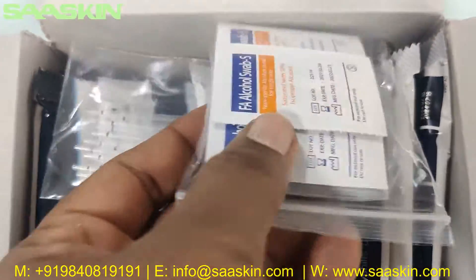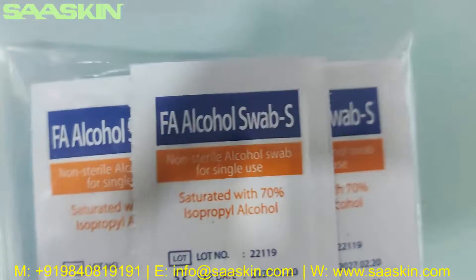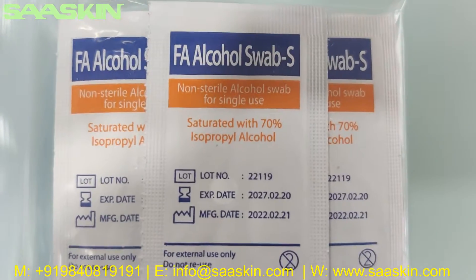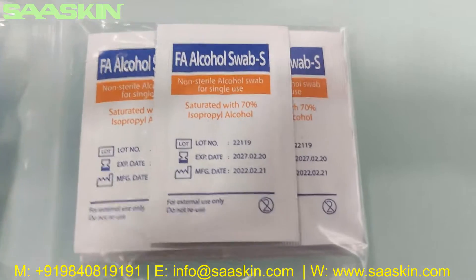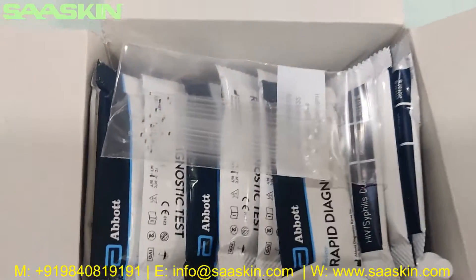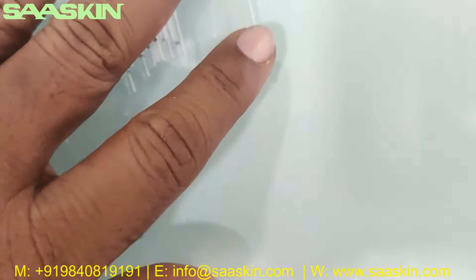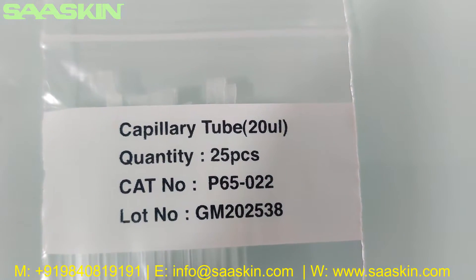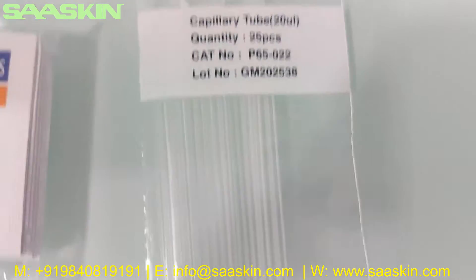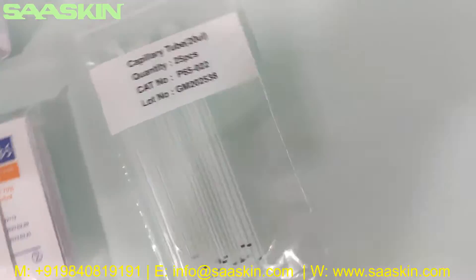There are also 25 alcohol swab packs inside. And further inside, you get 25 pieces of capillary tube — 20 microliters, 25 pieces. You can see the catalog number and lot number printed on the packaging.